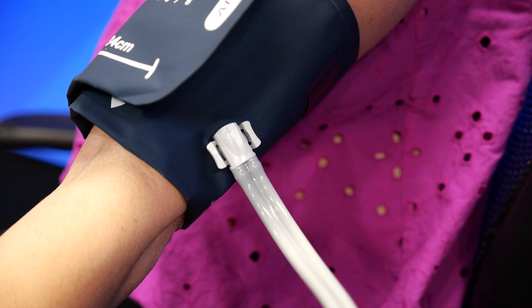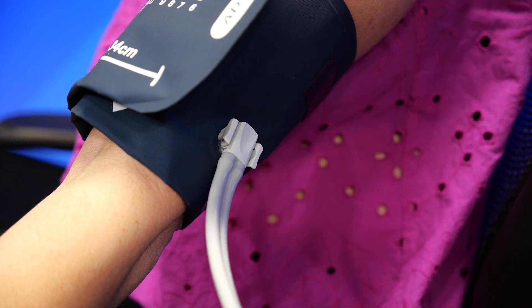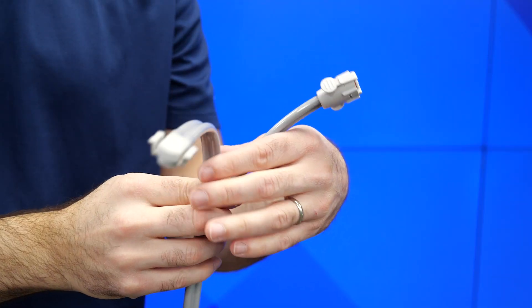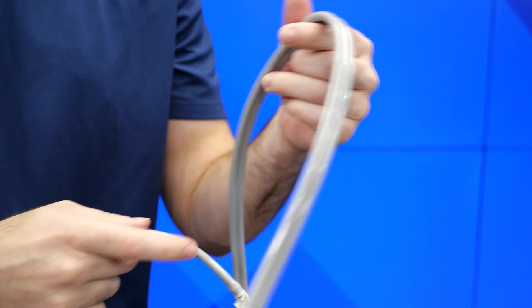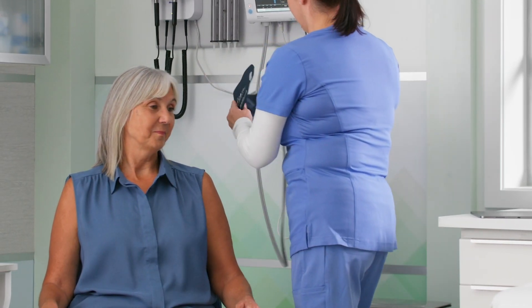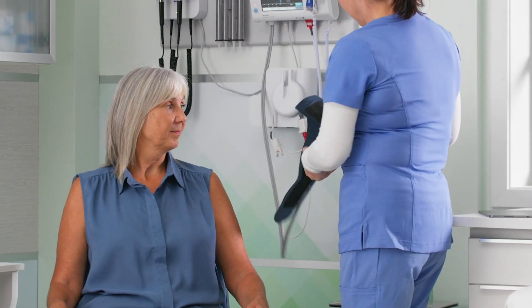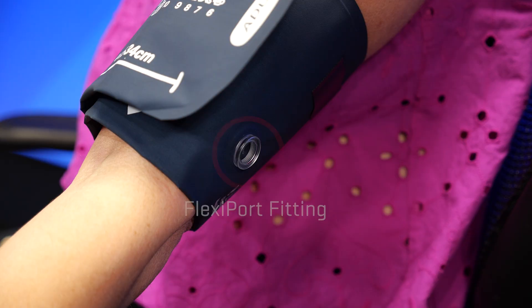Fourth, rotate. With a FlexiPort cuff, you have the ability to rotate the device tubing 360 degrees. This provides relief to common issues such as kinked BP tubing and readjusting or reapplying cuffs on the arm when patients are in a specific surgical procedure position or are restricted in recovery positions. It's also important to note that you always want the FlexiPort fitting or port on the outer portion of the extremity.